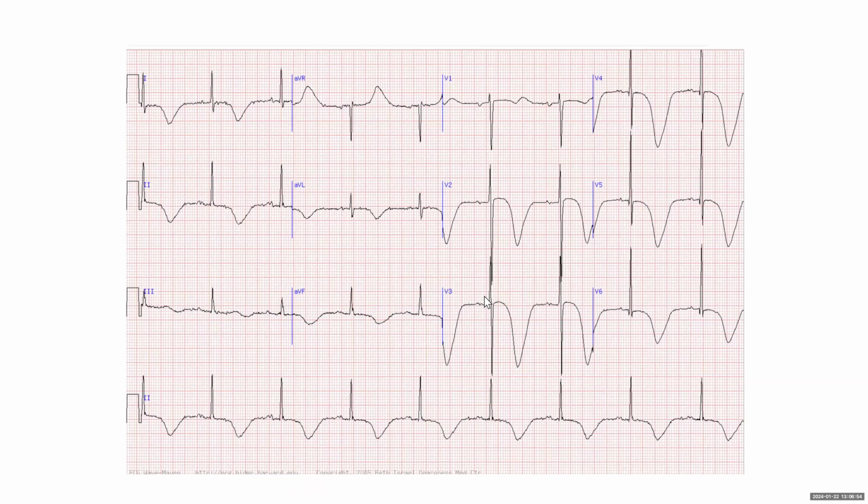And you guys know what's the definition? When do you call it giant T-wave inversion? Yani not any inverted T wave is going to be giant. There has to be a definition.